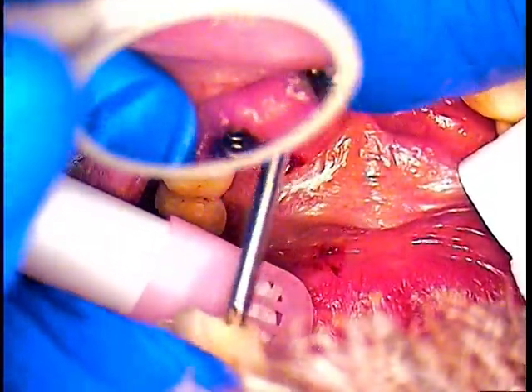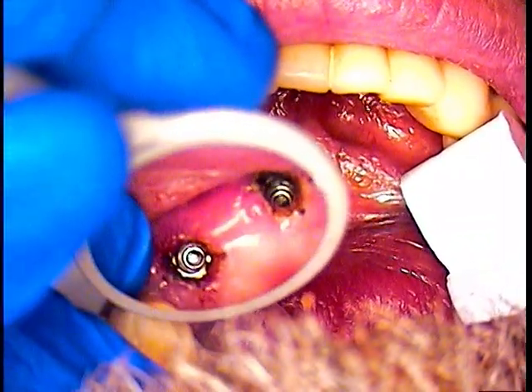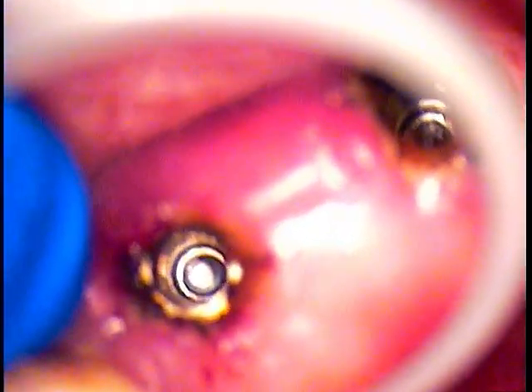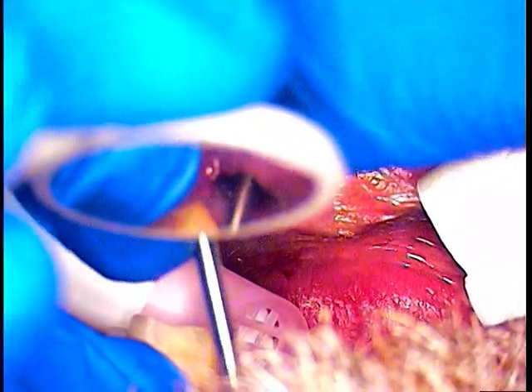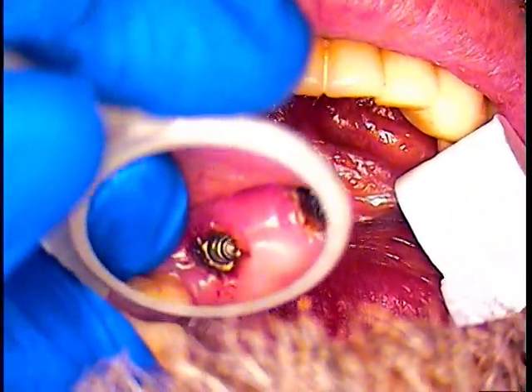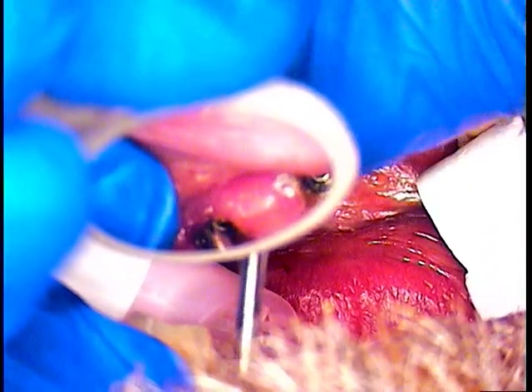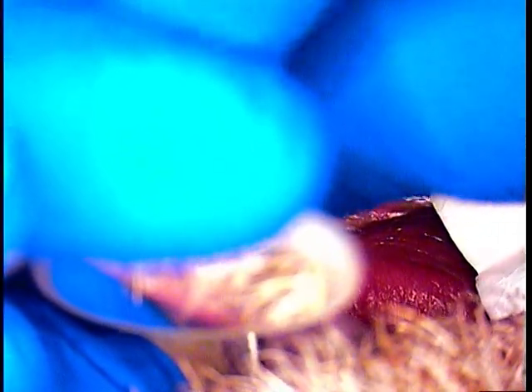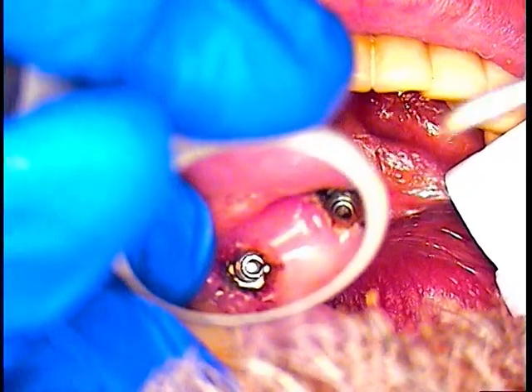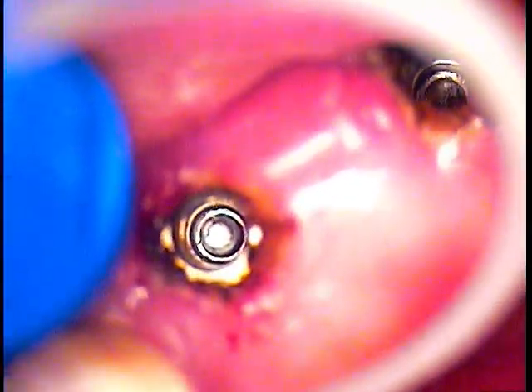Same scenario. Go back in, take a look and see where that leading fragment is. It's in the 12 o'clock position, so I'm always keeping that in mind as I'm turning, because you really can't feel a whole lot. It doesn't lock on, it just rests on top of the fragment as I'm turning counterclockwise. And it's almost out. A little more. It's turning gently. And just about out now. Stay on the top and rotate.